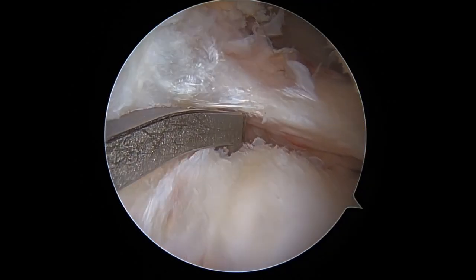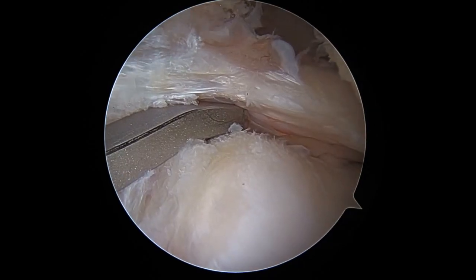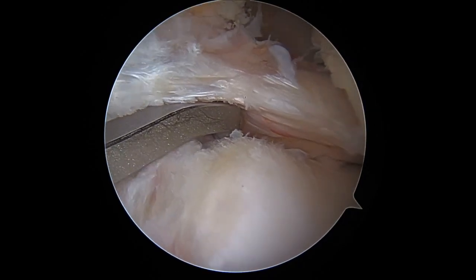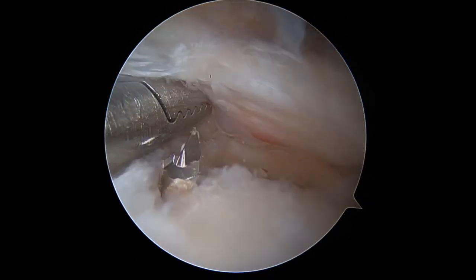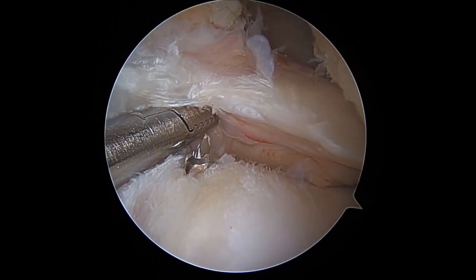With the knee in the figure 4 position, a point-to-point meniscal root marking hook is placed through the inferior medial portal with the precision aiming guide directly over the posterior meniscal root footprint. A 2.4mm cannulated pin is used to drill a trans-tibial tunnel until it reaches the tip of the marking hook.